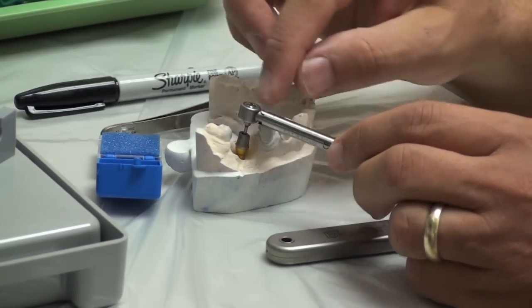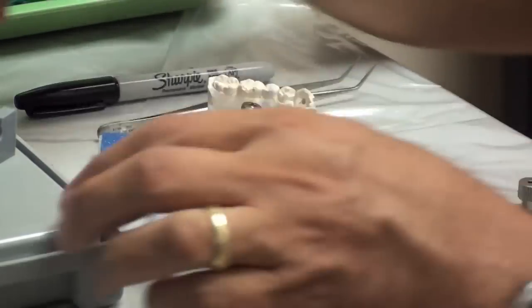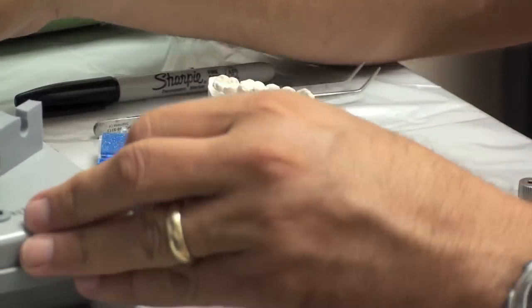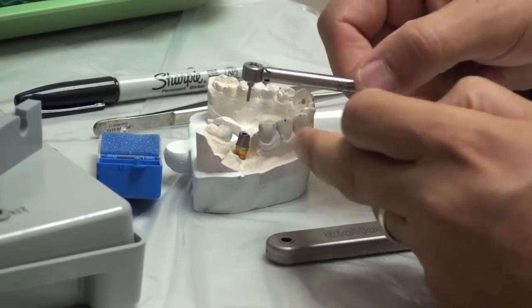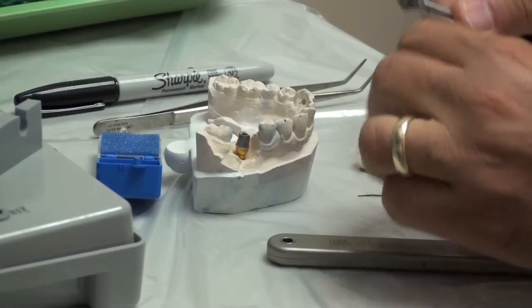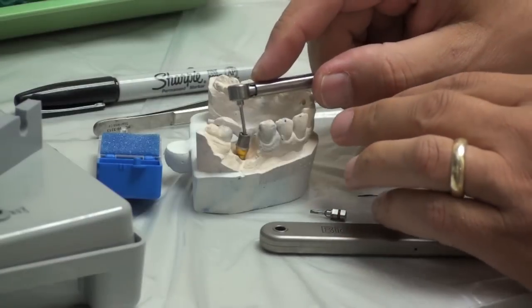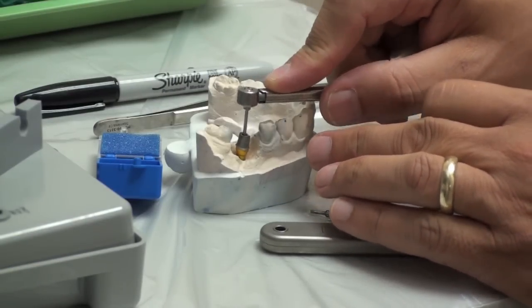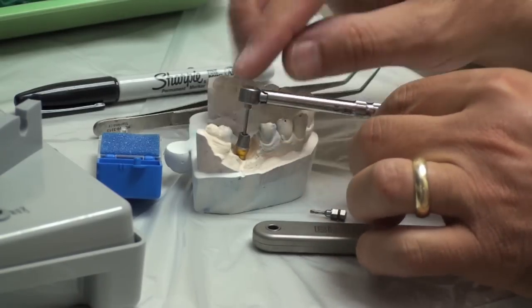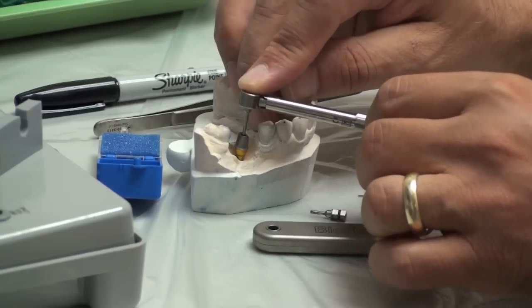If I was not able to do that because of the patient's cheek, I would need a longer hex driver to bring me up over the top. Here's my longer hex driver. Let's say the cheek prevents me from doing that and I'm not able to get that in here - putting this longer hex driver in. And there we go.